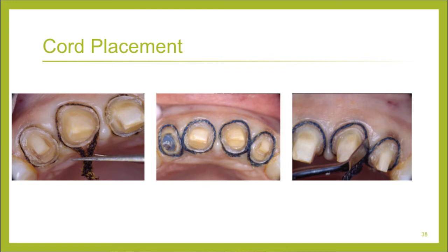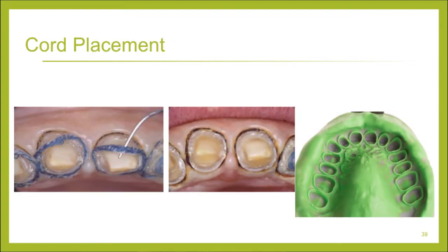I do love packing cord, but I also know what it does for our impressions, and I am really big on this. I think that there's no compromise. It's great to have the lasers that we have out there, and we utilize those, but we still go back to cord. There's nothing any better. If you can train your assistant to pack cord for you, it's going to cut down a lot of time, so while the doctor goes and checks hygiene, I can do this. So I'll pack the first cord, then I'll come back and pack the second cord, and before we take the final impression, we're going to pull that.